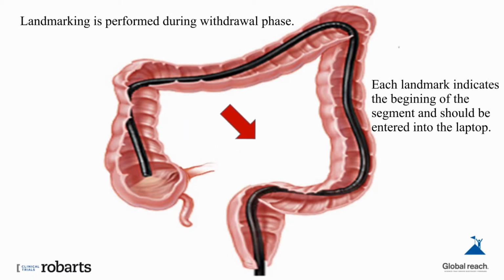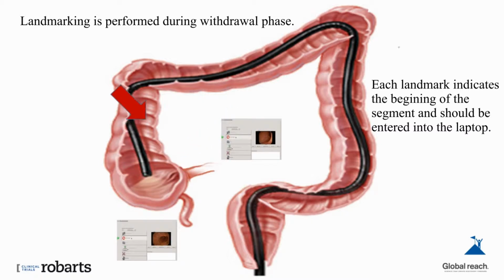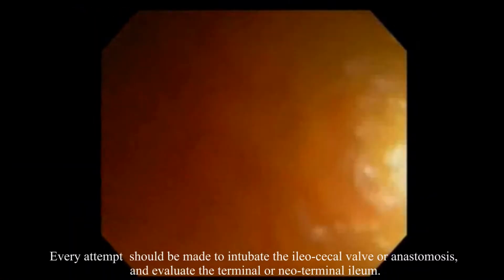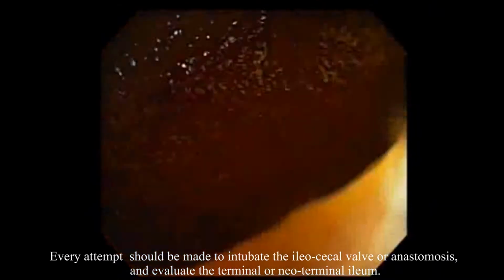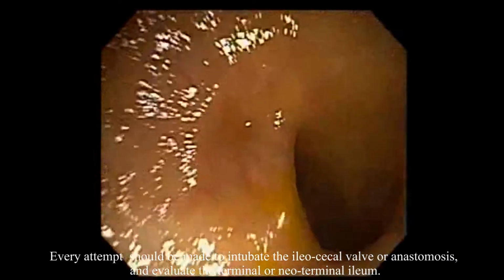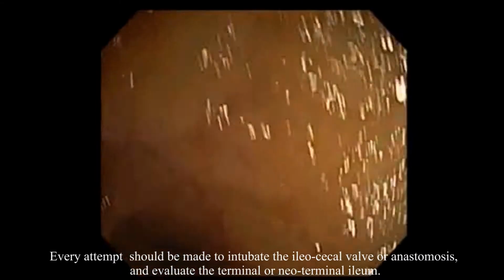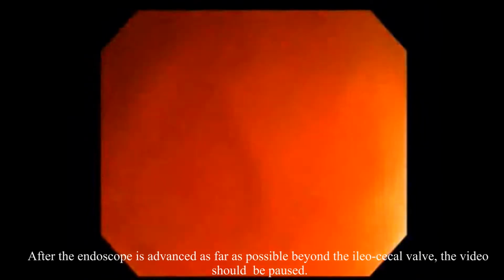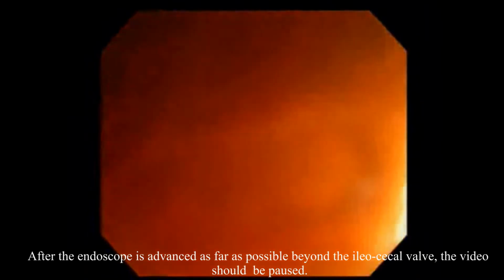Landmarking is performed during withdrawal phase, starting from the terminal ileum to the rectum. Each landmark indicates the beginning of the segment, and should be entered into the laptop. Every attempt should be made to intubate the ileocecal valve or anastomosis, and evaluate the terminal or neoterminal ileum. After the endoscope is advanced as far as possible beyond the ileocecal valve, the video should be paused.